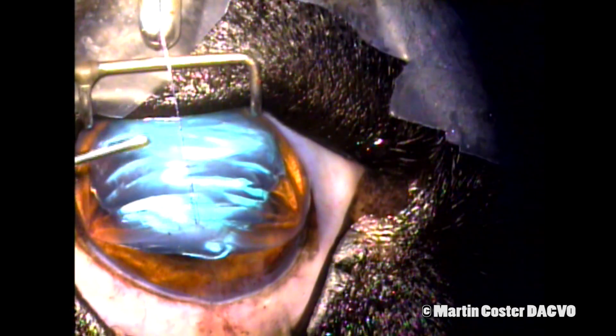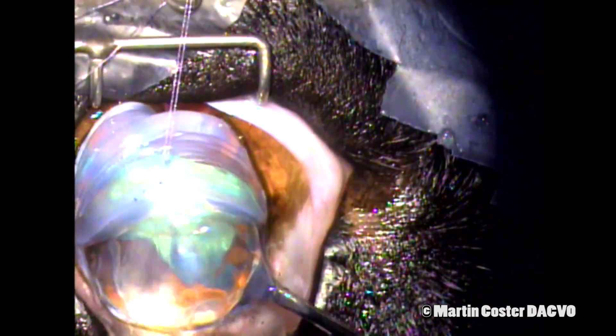During surgery we also are sure to keep the cornea well lubricated by using balanced salt solution. We're now delivering the lens using a lens loop below the lens and placing counter pressure with a cyclodialysis spatula on the other side.